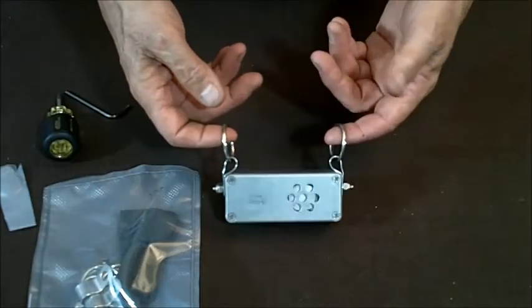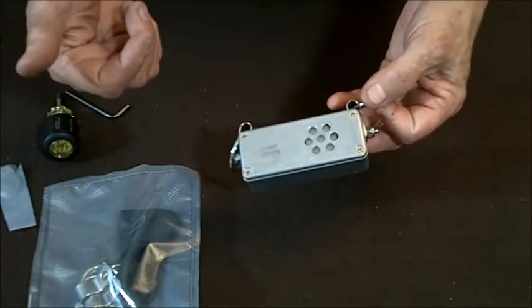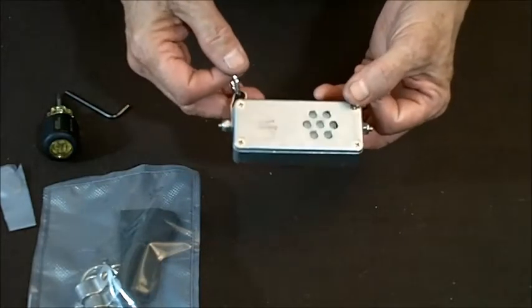Now, if you get this and you put it on your dog and it's working, you can hear this thing ticking. You're only going to hear it ticking if you put it right up to your ear. And it's a very faint tick. If you don't have very good hearing, you might want to have somebody else check to make sure it's running, because it's a very, very faint tick.